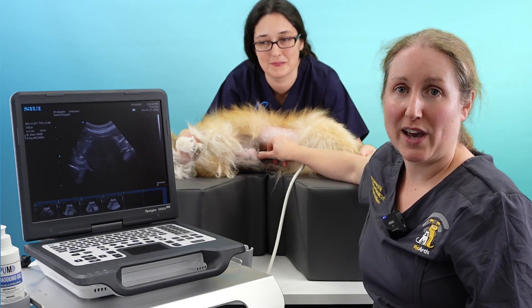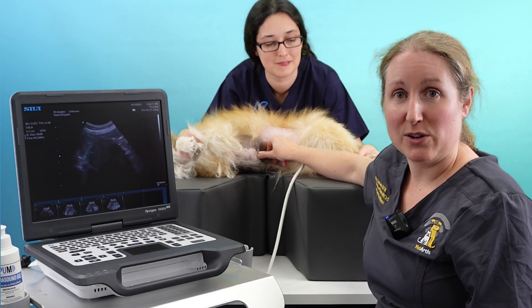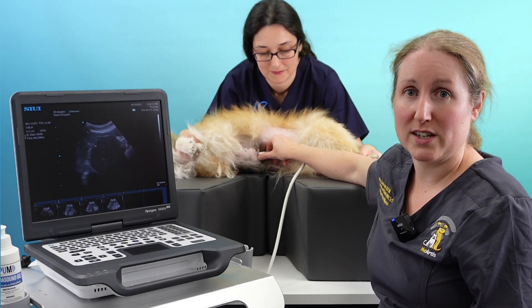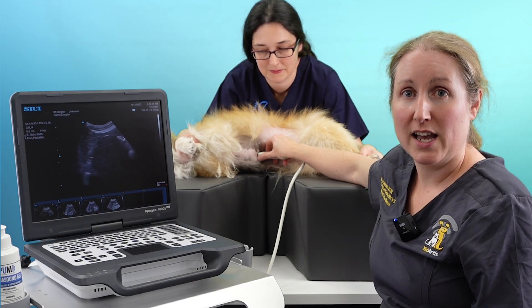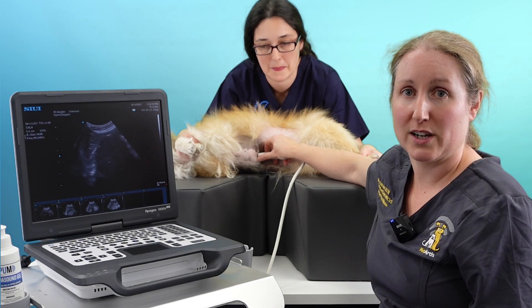This short video is going to show you how to scan the liver of a dog. First, when we want to scan any organ, we should have a little review of the basic anatomy so that we know where we're going to find it and what kind of probe movements we'll need to use to define the organ.